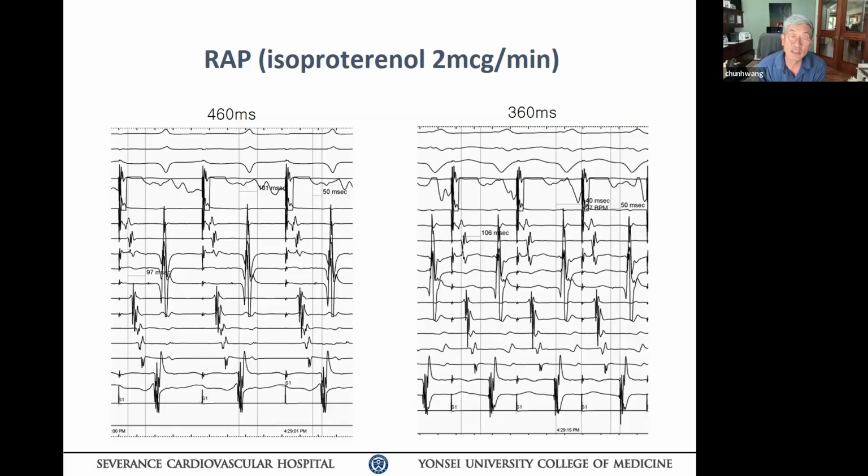So next time, before you say that this is not ventricular, all that is important. But I think when you do intracardiac measurement, changes should be appropriate according to what you're thinking. Got it? Okay, good. That's all I have to say.